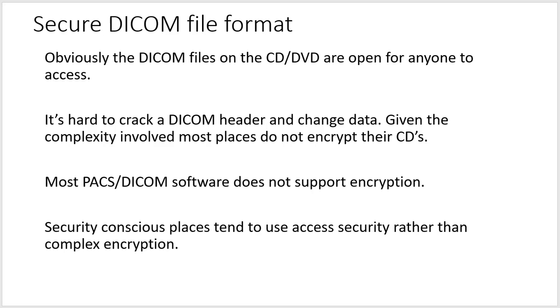And last but not least, obviously DICOM files on a CD or DVD are open for anyone to access. It's hard to crack a DICOM header and change data. Given the complexity involved just in DICOM, most places do not encrypt their CDs. Most PACS DICOM software does not support encryption. Security-conscious places tend to use access security rather than complex encryption.